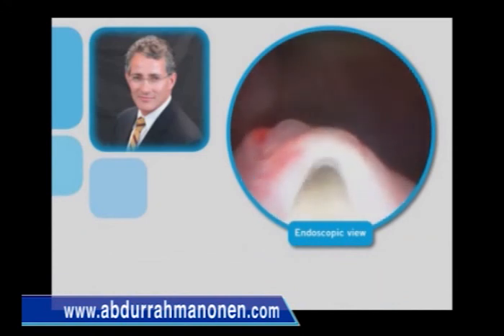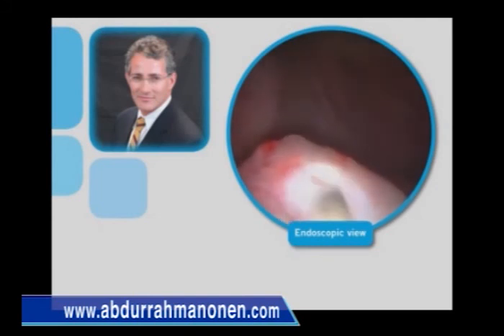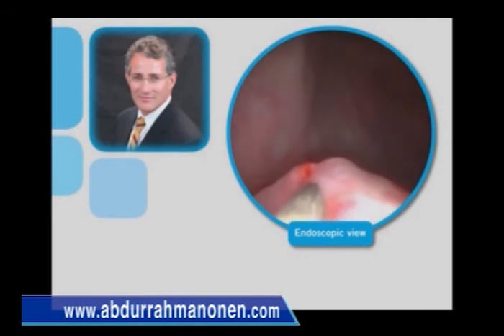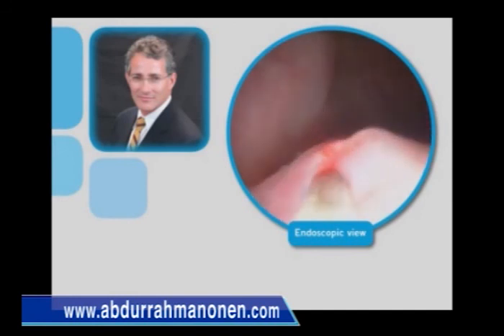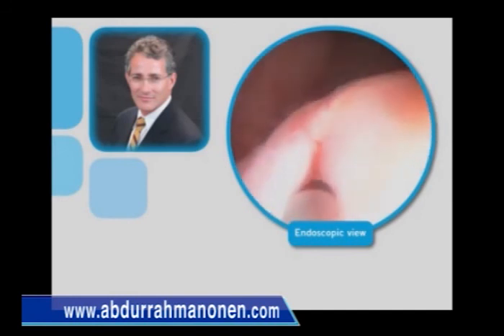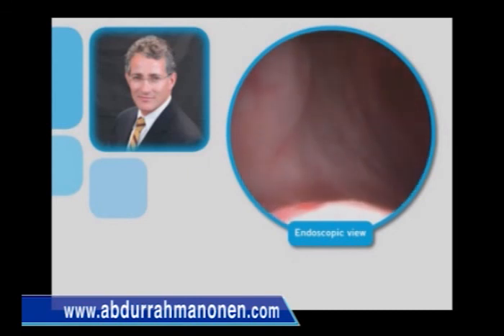Inspection of the final product will show that the ureteral orifice as well as the tunnel is coapted, and hydrodistension will not allow the ureteral orifice to open. Use of the 3 French whistle tip catheter here identifies both orifices, and they are both noted to coapt.